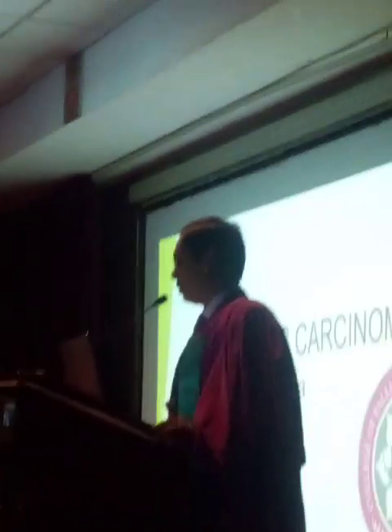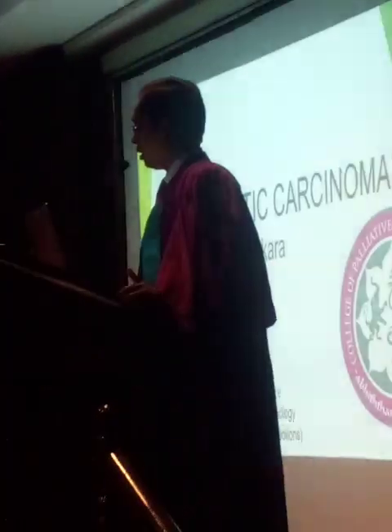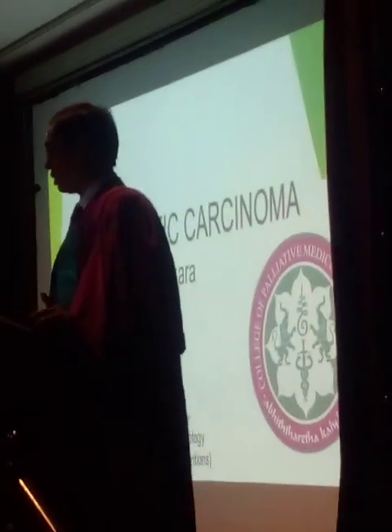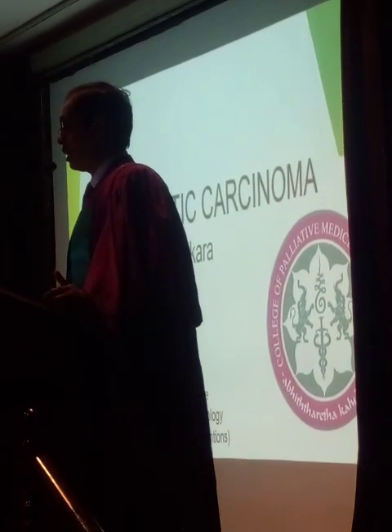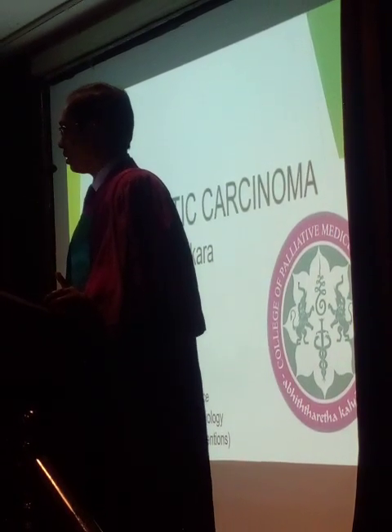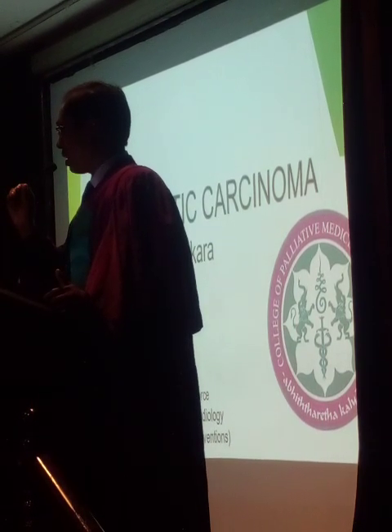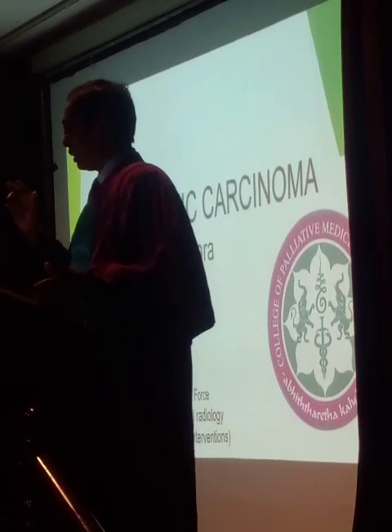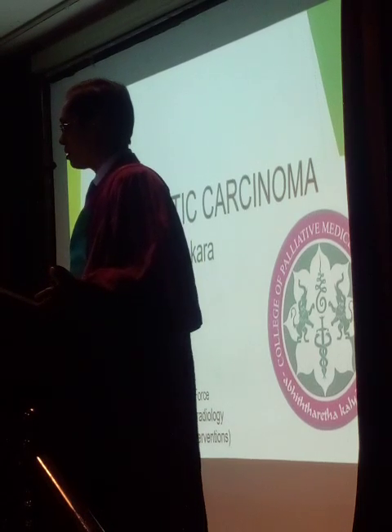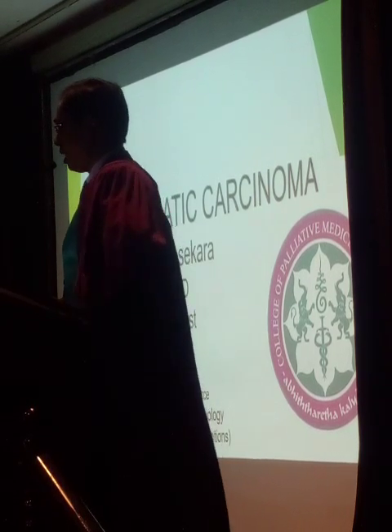So my part is actually the imaging part of pancreatic carcinoma, and actually we have intervention and management parts, but with the time I would like to focus on the imaging part because it is the most important part to diagnose a pancreatic carcinoma, because as you all know it's a very notorious cancer. If you diagnose it as early as possible, you will be able to do something and treat the patient.